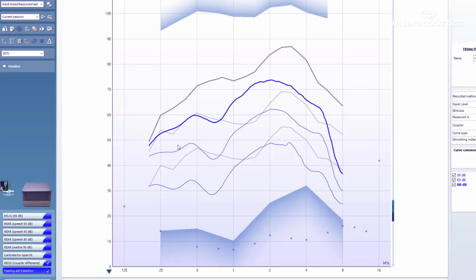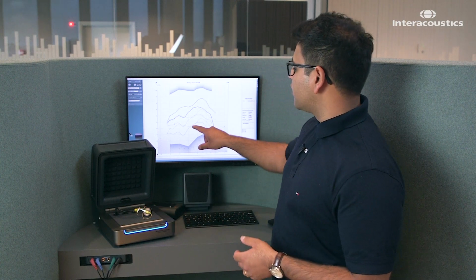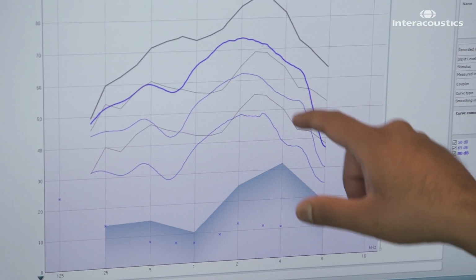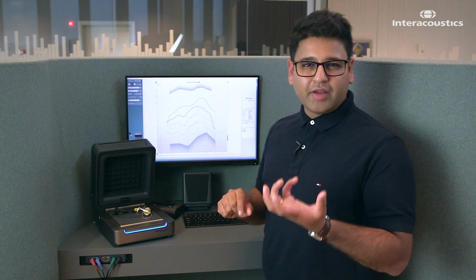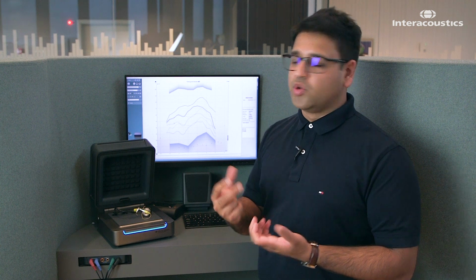So here we have the measurement that I've just made a moment ago on their existing hearing aid. So this is the hearing aid here. We can use this measurement to then compare its actual performance against what a standard fitting algorithm would perform. And again, remember, this is the sound that the patient likes. This is what they're used to. This is their preference for audibility.